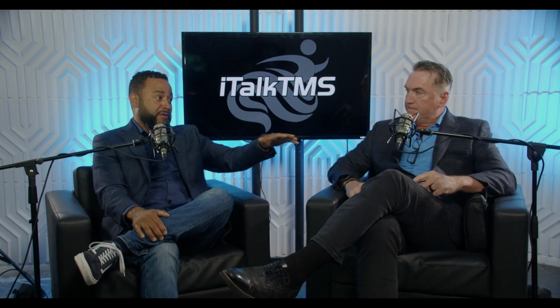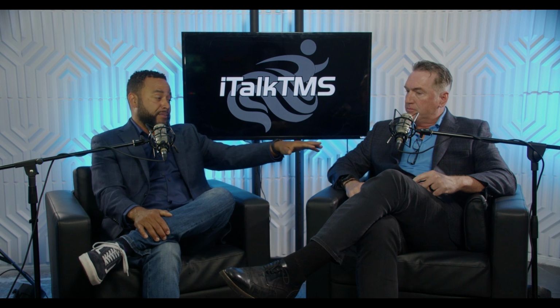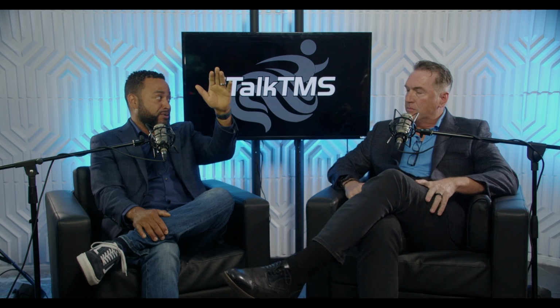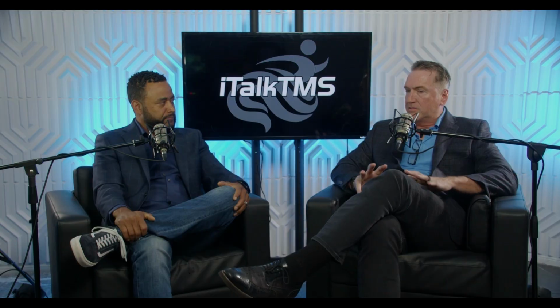and that allows us to fine-tune the delivery and the protocol regimen. And that's going to be the biggest difference between TMS and PRTMS, is my understanding at least. TMS is you're doing the same thing for the entire amount of sessions you're getting, but it sounds like with PRTMS you're slowly building and getting higher and higher results. Well, I would say, yeah, standard TMS treats one location with one frequency. Okay. And we treat 5 locations with multiple different frequencies, depending on the location and what the EEG looks like.